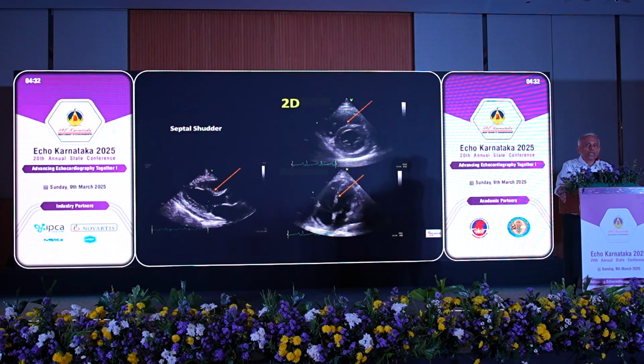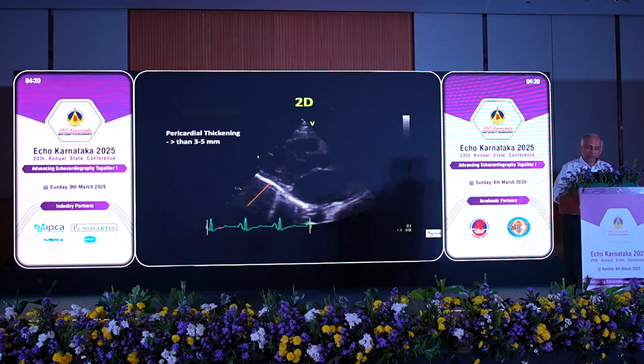So these are very classic patients, and this is something which should never be missed. And sometimes they are very subtle, so you have to be very careful. So look for these views, and many times just by looking at them, you know that you're dealing with CCP.